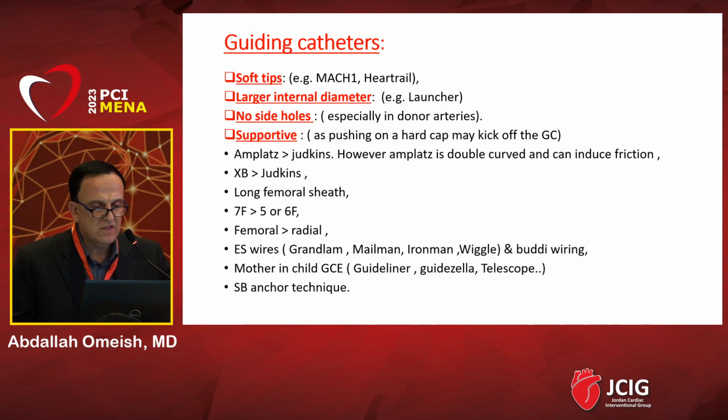However, in complex CTO PCI, the success rate with the radial is significantly lower than the femoral. Using at least one transradial access was feasible in some registries. However, they were associated with longer fluoroscopy and mean procedural time.